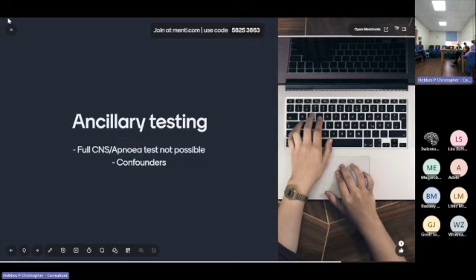And ancillary testing is a specific sequence of radiological scans to demonstrate that there is no flow within specific regions of the brain, and Dave's going to talk to you about that shortly. But from our side, the test is requested in a specific way. So we'll be requesting a CT angiogram to support testing for brain stem death. And we'll be discussing that as a consultant from the radiology side to make sure the test is performed by the correct protocol.